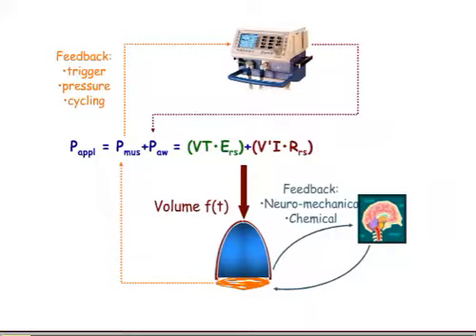And again, this will influence the patient's respiratory drive and muscle action, and we go into one of these loops that go on, and hopefully they should not be too badly asynchronized, but unfortunately, given what I've shown you on my preceding slide, it's to be expected that they are not going to be a perfect match. And what we're going to see now is how to minimize the damage here in terms of asynchrony.